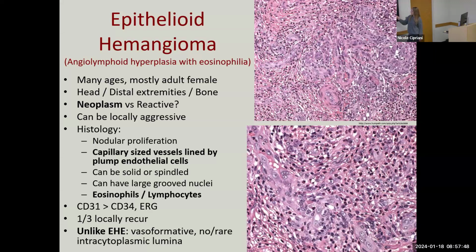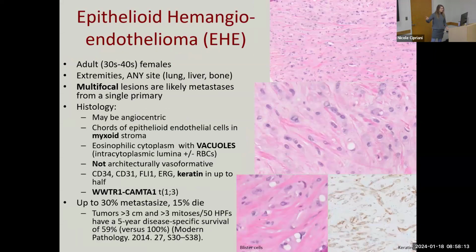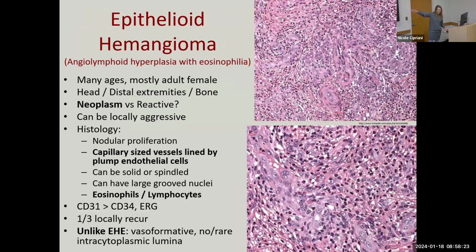What's often differentiating these from a true angiosarcoma is that they tend to maintain pericytes around them. I didn't have this written down here, but they tend to maintain the SMA-positive layer around the periphery, unlike vasoformative angiosarcomas, which are arguably even more cytologically atypical and do not have an SMA pericyte layer. But they are different from hemangioendotheliomas, which essentially are non-vasoformative, right? So epithelioid hemangioendothelioma is not really in your differential diagnosis of epithelioid hemangioma, right?